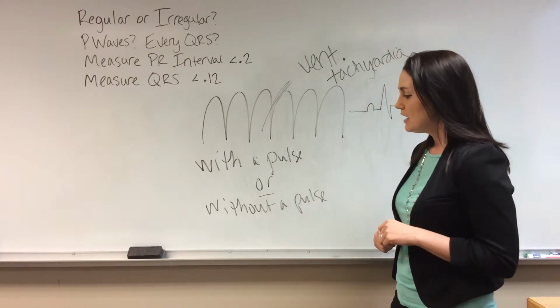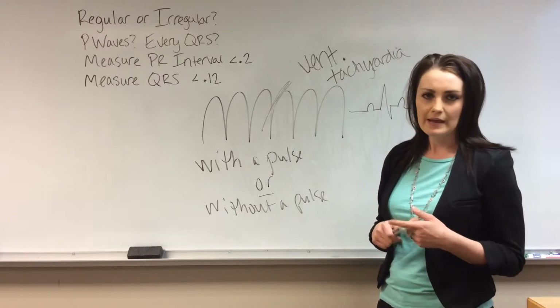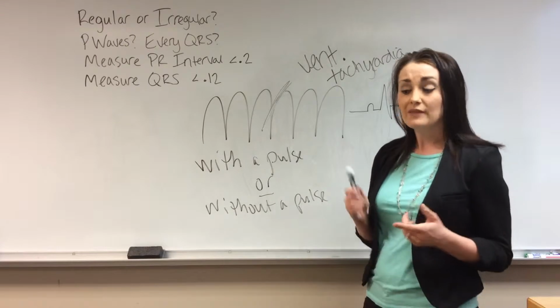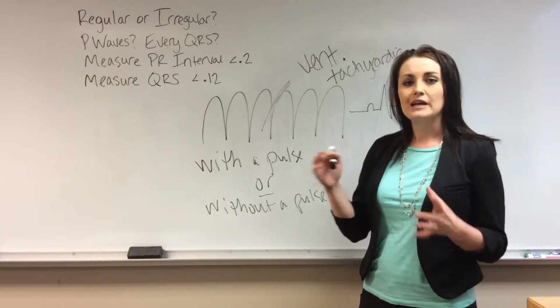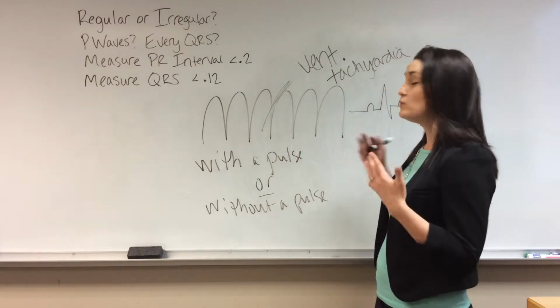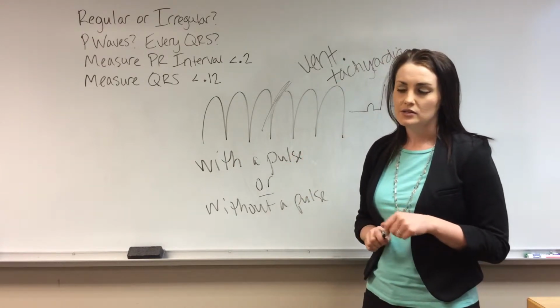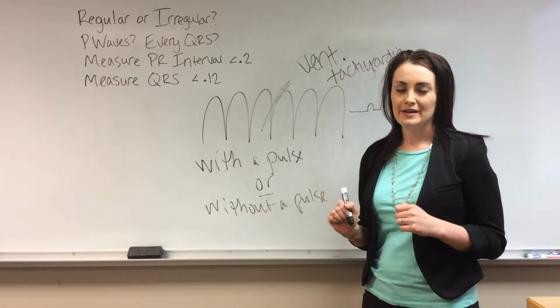We'll continue doing compressions, we'll intubate, and we'll give meds. We'll give amiodarone still, and epinephrine, and follow the advanced cardiac life support protocol. And with that, we will shock it too. It's going to be a defibrillation. This is considered a shockable rhythm.